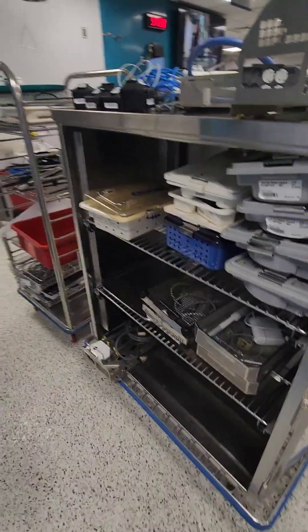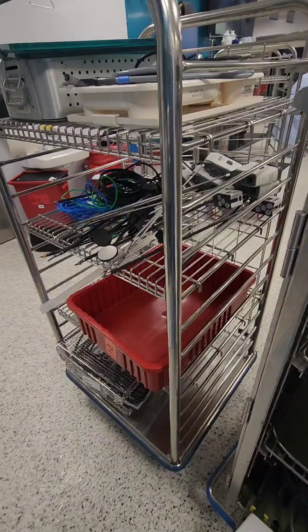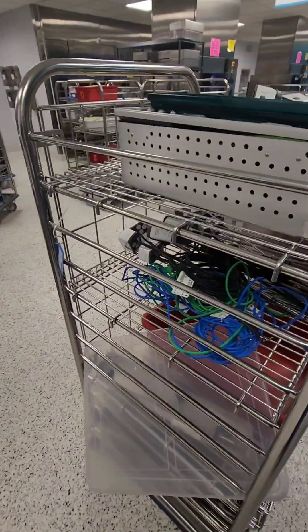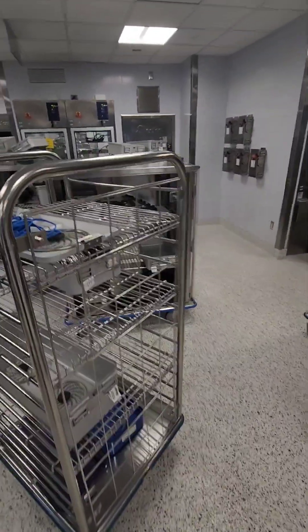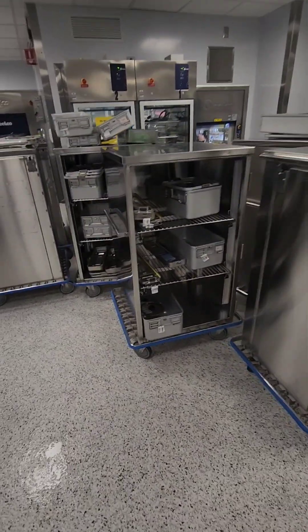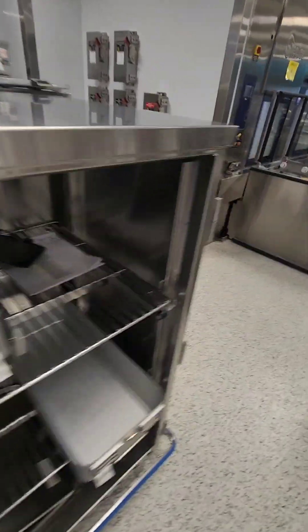Going back over to sink number two here with some of our hand wash items in there. Again the Da Vinci arm and Da Vinci accessories all up on a cart there — camera with the cords. So this is the hand wash station. Moving along looking at some more racks here, making our way through all the chaos that is decon.